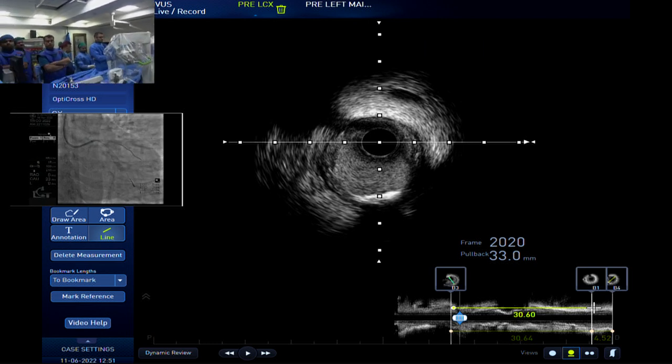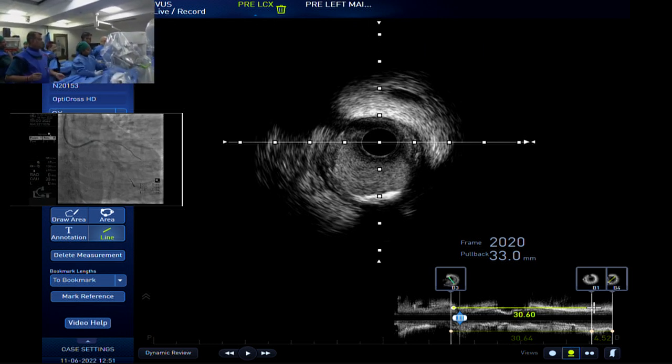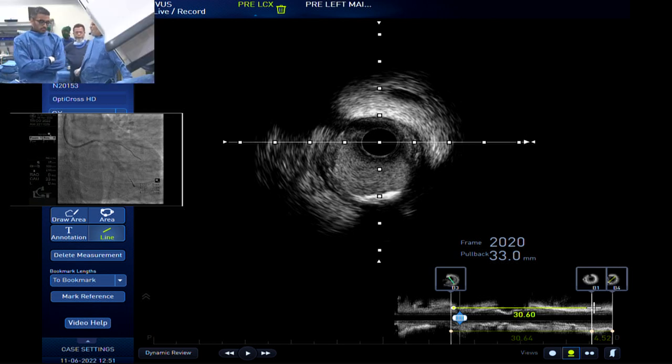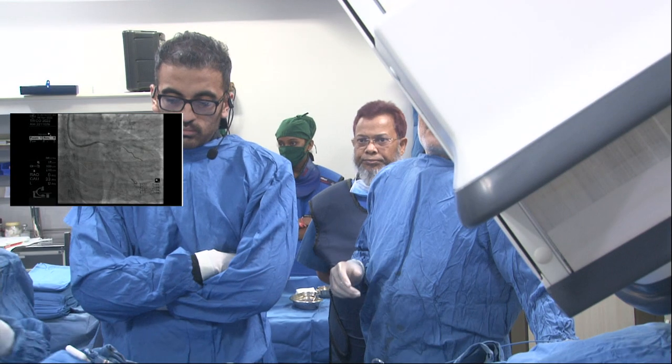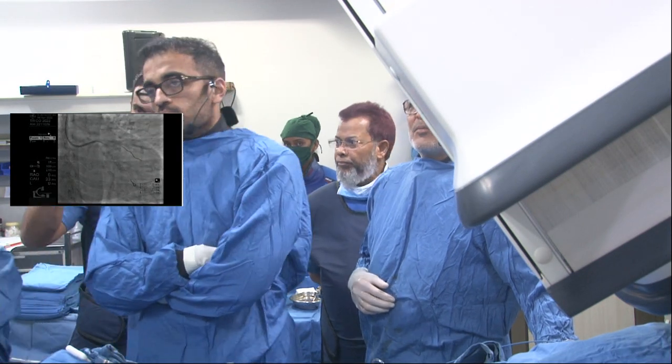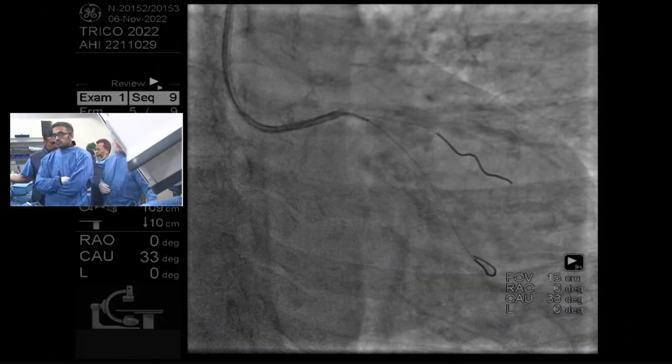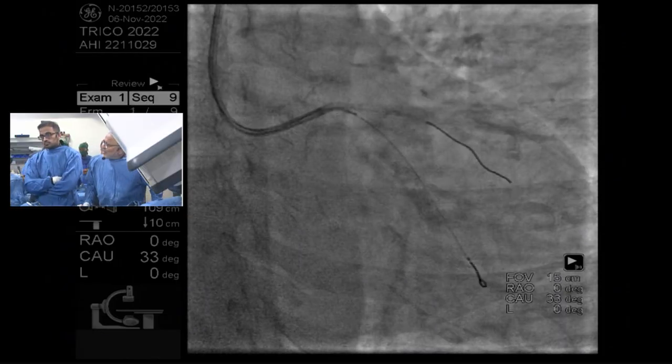So let's maybe get the stent out. If you're okay with a 2.5-32? 2.5-32. Yeah. Get me Synergy. And what you'll do is line it up with your proximal landing zone, because you know you have the length to get to a safe space distally, but the disease you showed is proximal.